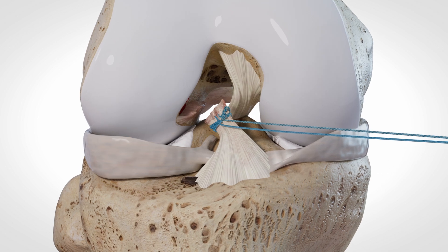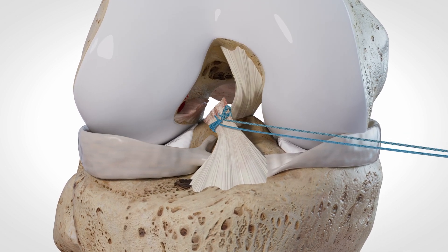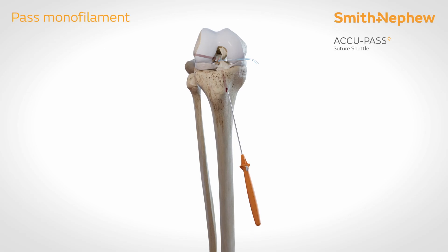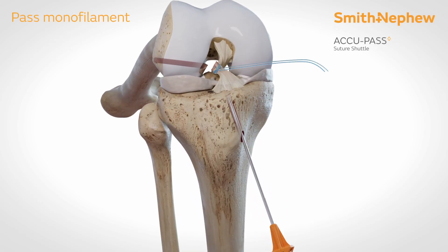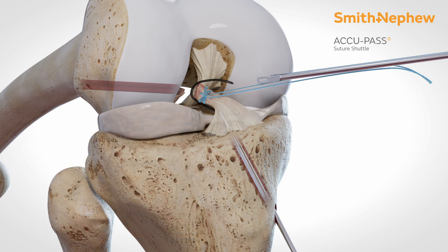Using a second ultra-loop, create another luggage tag, this time in the PL bundle. Using an acupass suture shuttle, introduce a monofilament into the joint and dock it outside the portal.